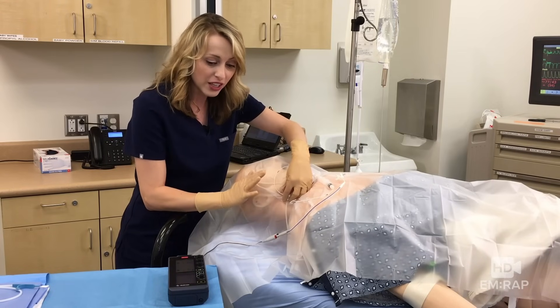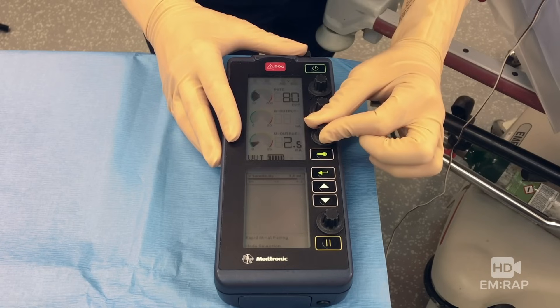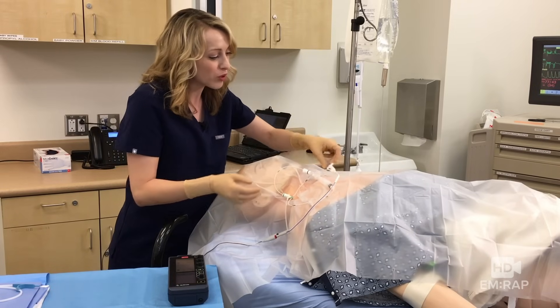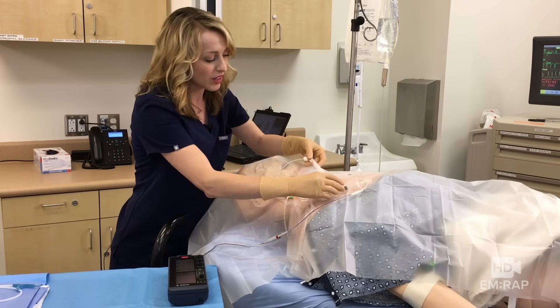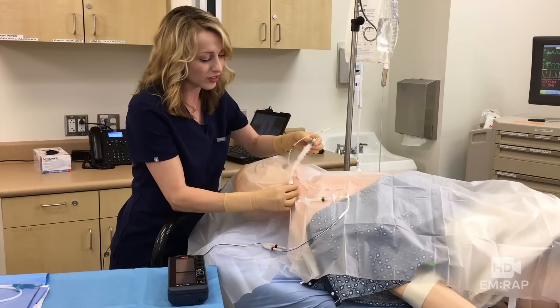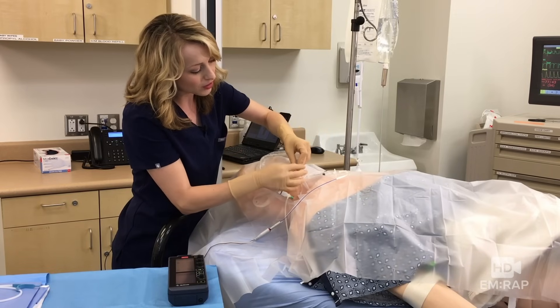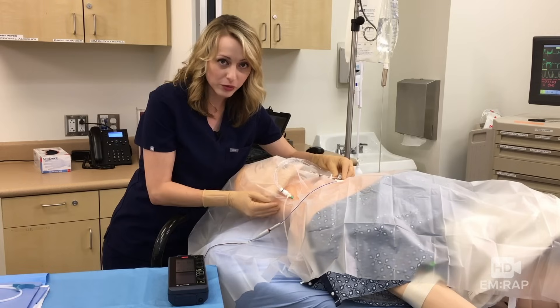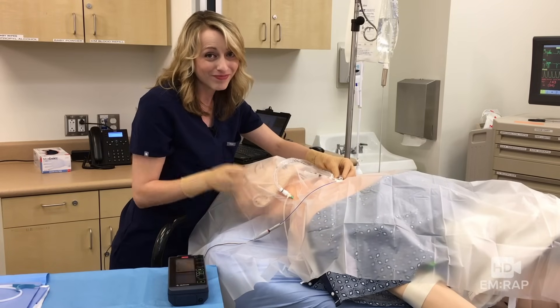Once you like the positioning, adjust the pacing generator by turning down the output until you barely lose capture, then turn it back up again. With good capture confirmed on the cardiac monitor, deflate the balloon and lock the stopcock in place. Pull the sterile sleeve all the way down to the cordis — it connects and locks when you twist the piece, locking it in place on the pacing wire. Secure everything with sutures and a sterile dressing, and you should probably call a cardiologist. I'm Dr. Jess Mason, and this is MRAPHD.